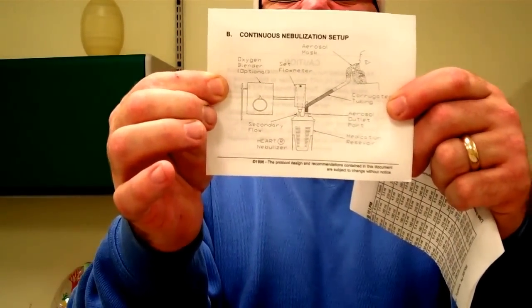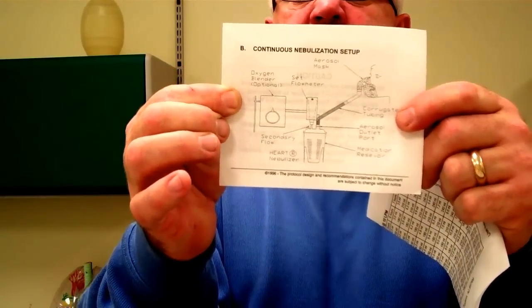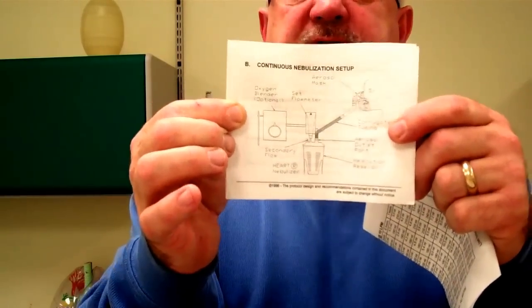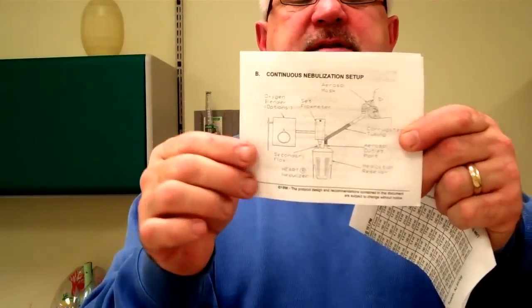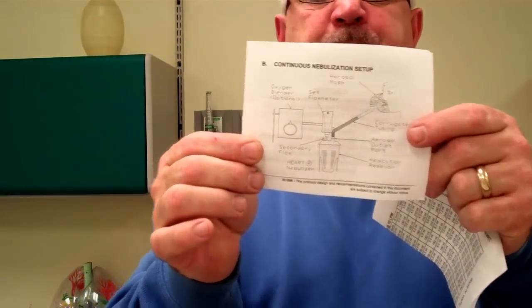It also tells you that you can set it up for 10 liters per minute to give an output of 30 milliliters per hour, or you can set it at a flow of 15 liters per minute on the flow meter to give you an output of 50 milliliters per hour. So based on what you set your flow meter at, that's going to determine how fast or what is the output of the device.